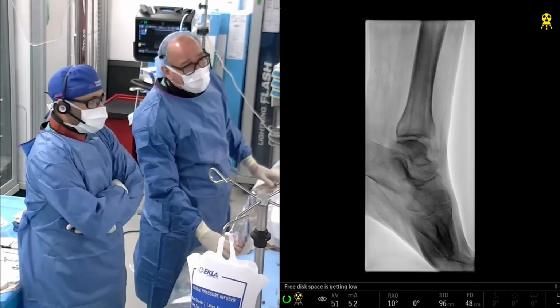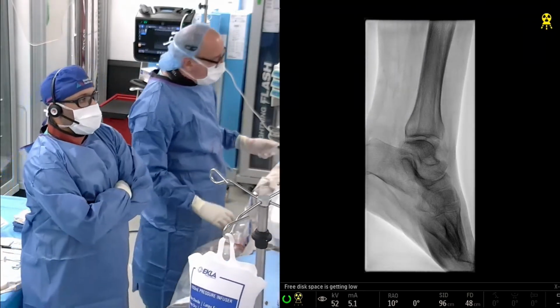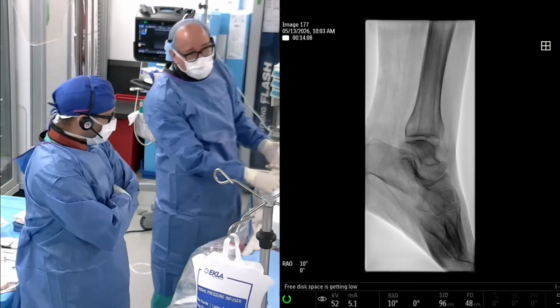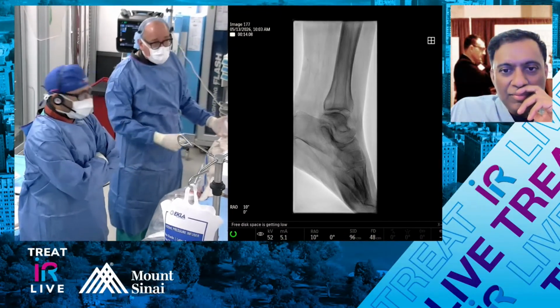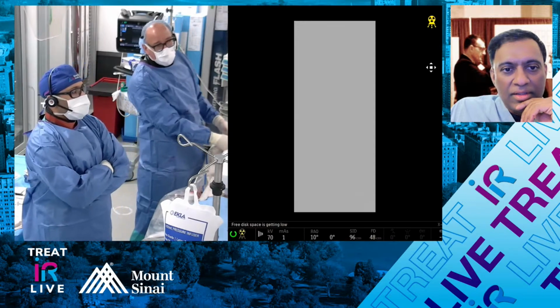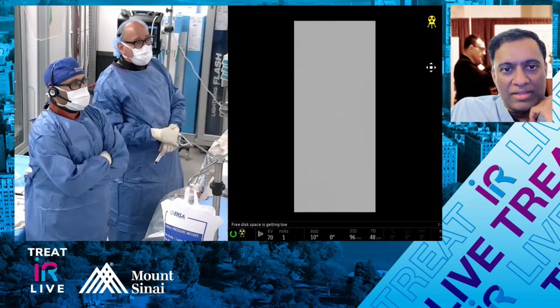Oh, I think we have a special guest coming in. And so, Joji, if you're online and you want to comment on what you're seeing so far, I'm going to shoot the lateral foot. If you can hear me, just confirm that you're online. Yes, I'm online. Yeah, I can see it. Oh, looks fabulous.